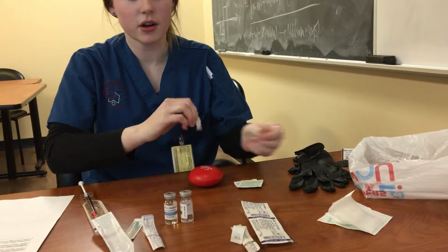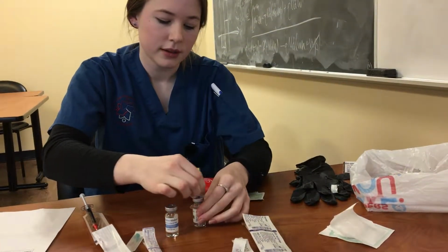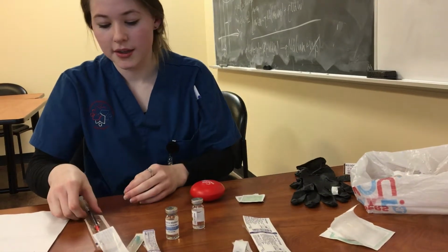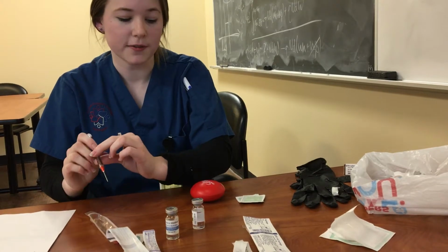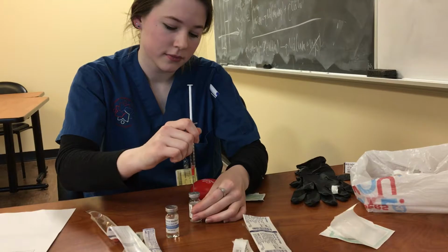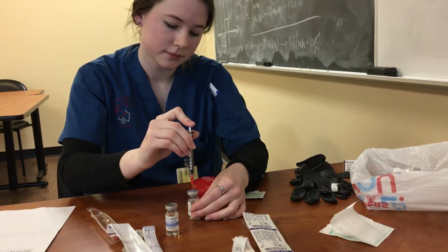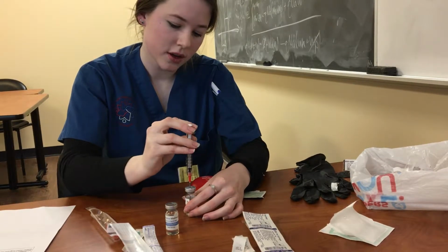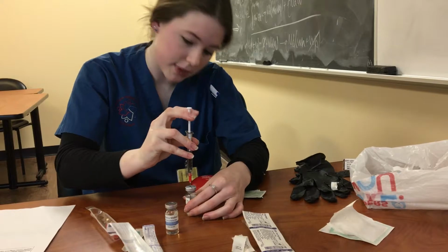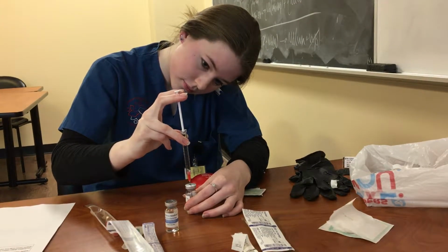So I do want to alcohol swab the vial that we're going to be using in an inner to outer fashion and let that dry. Now that I've kept this here in the little house in my sterile field, I'm going to aim for the bullseye and inject the air into the medication, followed by withdrawing 1 milliliter of the medication that we're going to be giving. Okay.